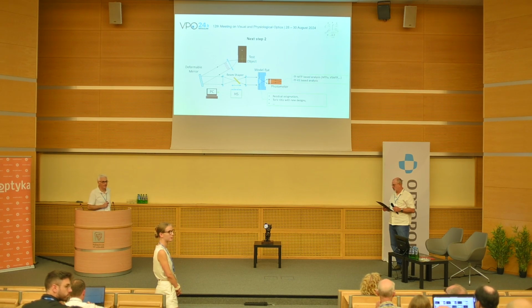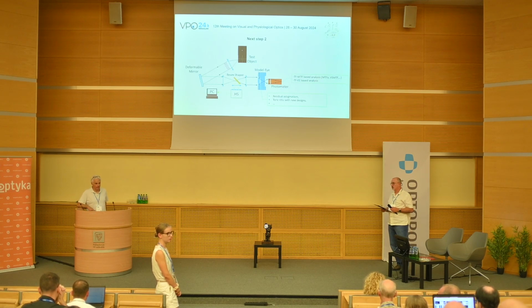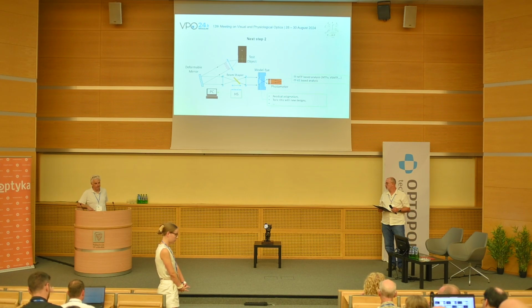I know, but I would encourage you that we need to do some educating about what is visually significant. I think the clinicians as a whole need to have a bit more understanding of what's actually happening visually, as opposed to focusing on the MTF that's ignoring the phase transfer function. Yes.